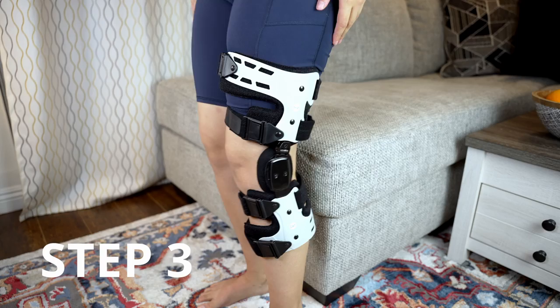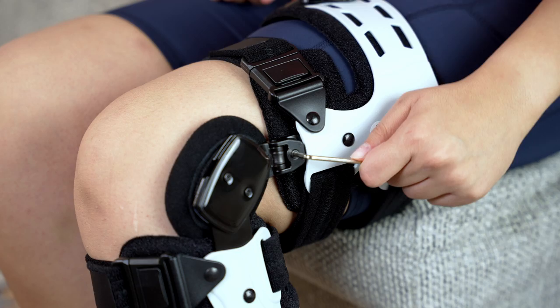Stand up and adjust the tightness of the straps. You can also adjust the hinge if you feel any discomfort, or add flexion or extension stops to limit the movement of your knee.